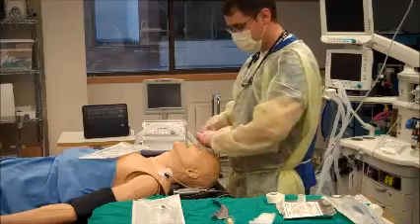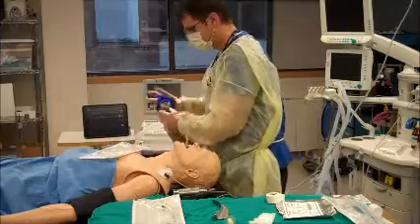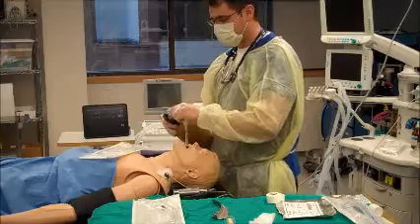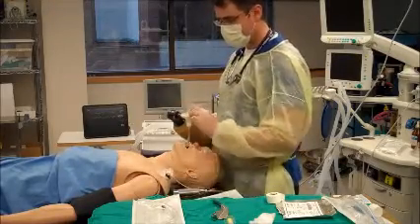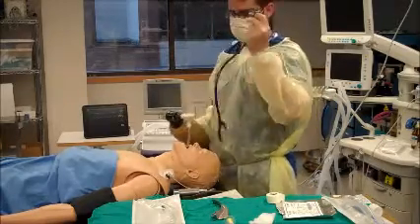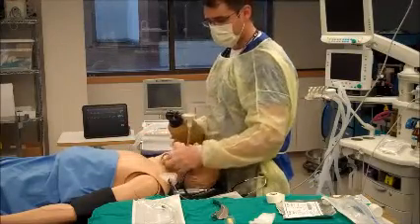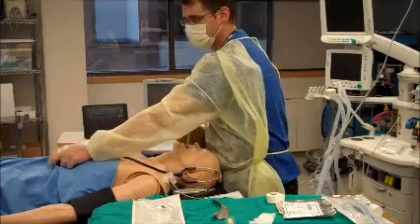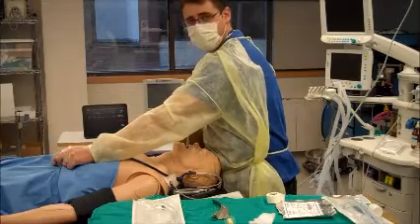Inflate the cuff, put my end-tidal CO2 connector on, take my resuscitator bag connected to oxygen source, and confirm placement. I can see chest rise, I've got CO2 color change, and at this point I take my stethoscope, listen for bilateral breath sounds, listen over the trachea to ensure a nice seal on the ET cuff, and finally listen over the gastric area to make sure there's no ventilation of the stomach or esophagus.